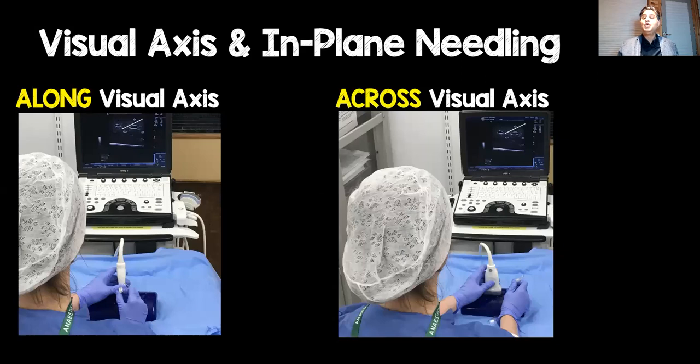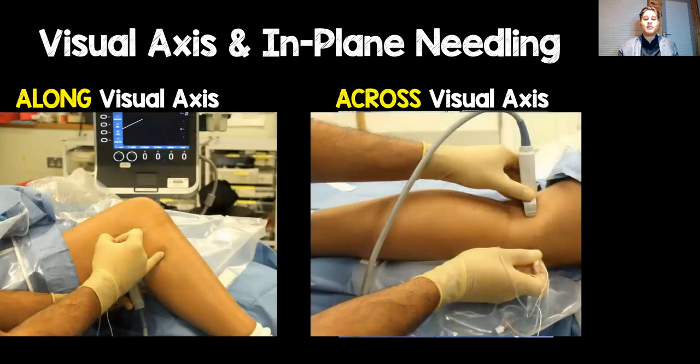Now, again, there are two different ways that you can needle in plane. You can needle in plane along your visual axis, or you can needle in plane across your visual axis. So on the left-hand side over here, you see Anne is needling along her visual axis, and the right-hand side across the visual axis. That'd be the same as doing a popliteal sciatic nerve block like this. So everything's beautifully lined up. I'm looking down the barrel of the needle and I'm looking at the screen, as opposed to turning sideways and kneeling across myself.